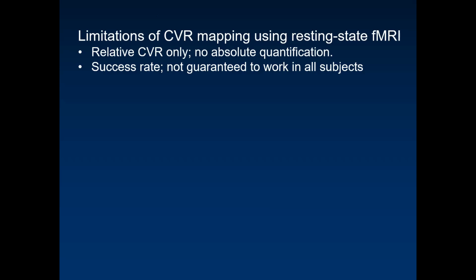And also the success rate is not 100%, because if the subject has no fluctuation in their breath patterns during the resting state scan, we cannot get reliable CVR maps in those subjects.